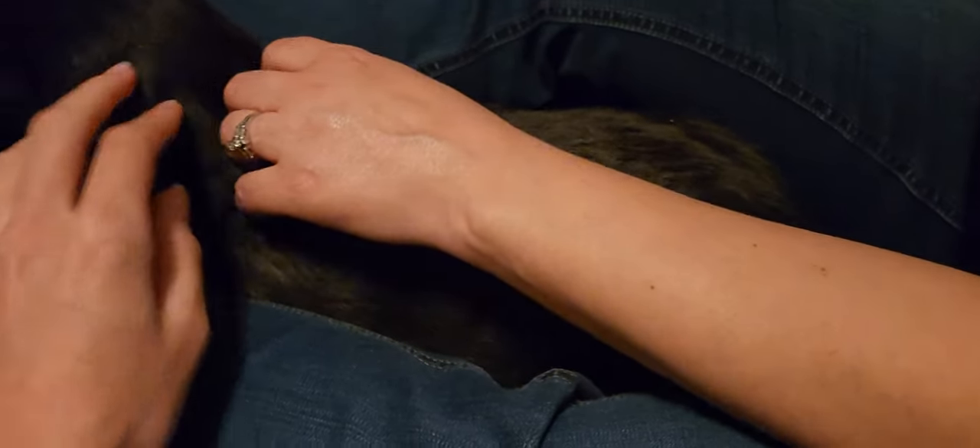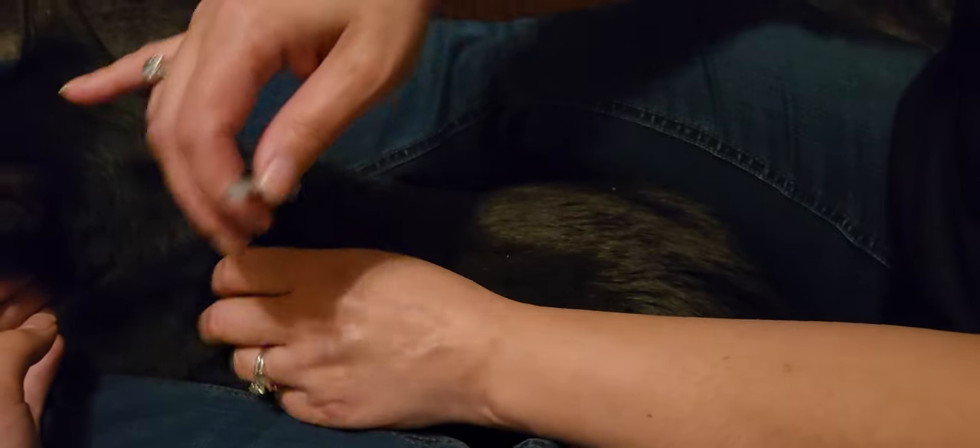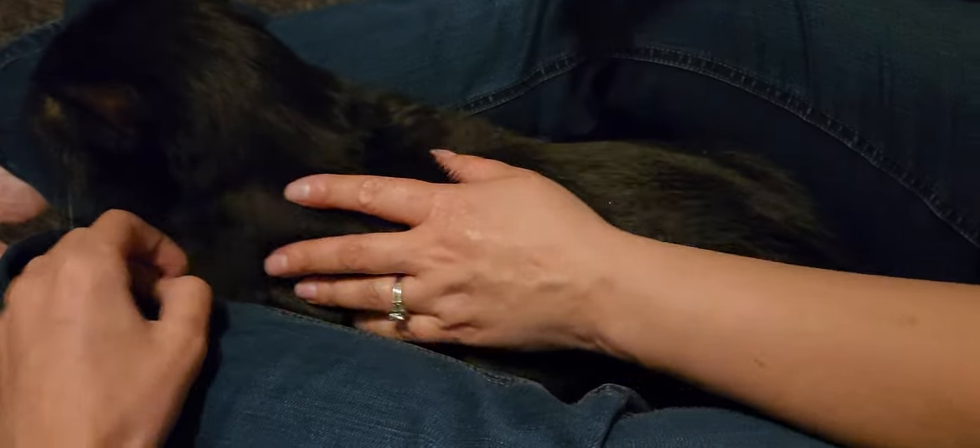I like to watch Max's ears because he will show me where an insulin shot might hurt. So Max, we're gonna give you your shot. Max usually doesn't like his shot right in here — see his ear twitching a little bit? He doesn't like that spot.